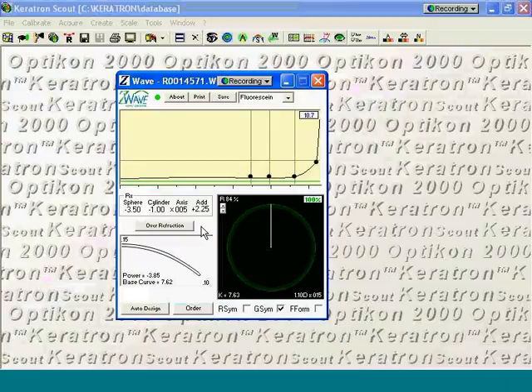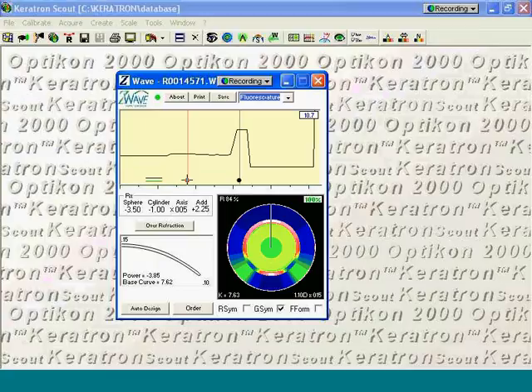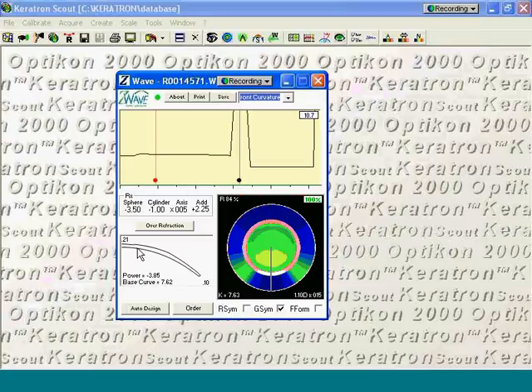There is another occasion where the lens will be made thicker because of prism ballast, and that is if on our front surface design we make the pupil less than 2.4. When we make the pupil that small, the design changes to more of a segmented type of a design. And with our add distributed only in the lower portion of the lens, this lens must orient properly, so there's prism included in the lens design.